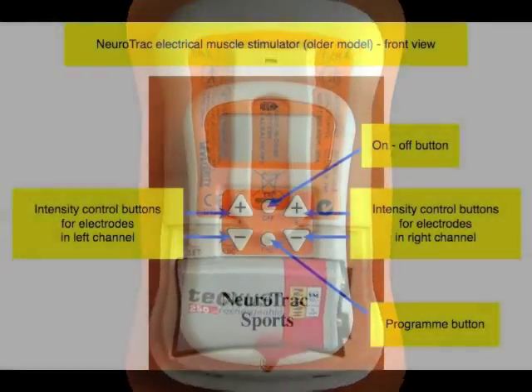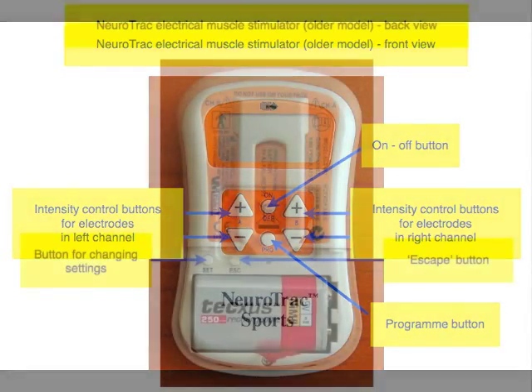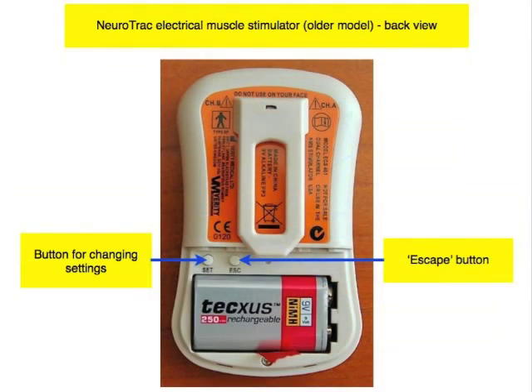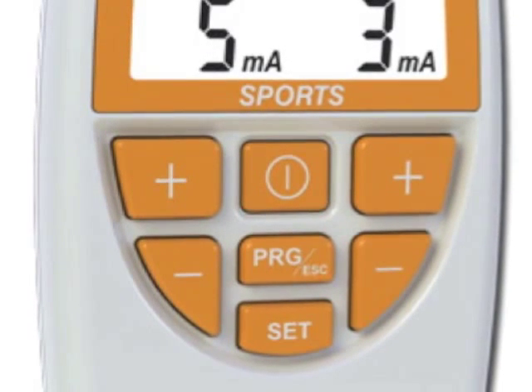On the older version of the Neurotrack sports, which has recently been replaced by a newer model, the main control buttons were on the front of the machine, including the on/off button, the program button through which you choose which program you want to work with whether preset or custom set, and the intensity control buttons which turn the current up or down. The button which controls changing the settings is in the back of the machine in the battery compartment. This is different from the new machine where all the buttons are on the front.